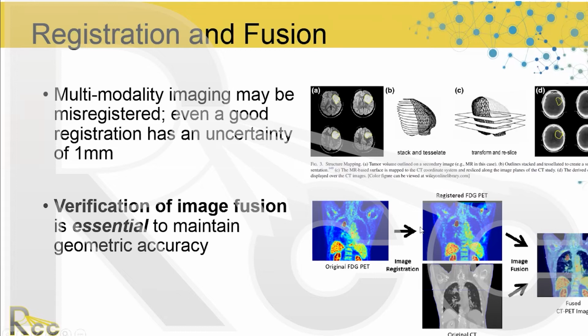And here, showing the PET CT and the way these are registered, they could be misregistered, and it actually does happen not infrequently. With the PET CT they do the CT first, a patient coughs, and then they're on the table for their PET, and that cough caused the misplacement. So in Eclipse, I've had to break the registration and re-register. This is just something to be mindful of and look for.